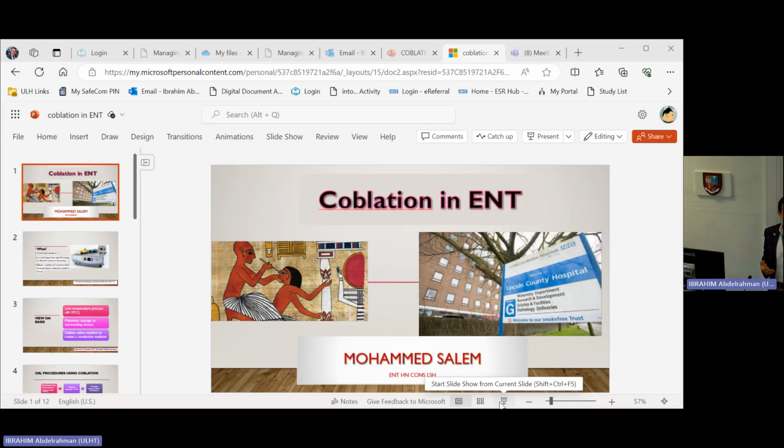But if you do the extracapsular, and Mr. Simon will show you some videos, you do it the other way, going between the tonsils, and because it will vaporize the tissue anyway, you vaporize the capsule more and separate the tonsils, like you're taking the tonsils from the back and pushing the muscles away. It depends on how much you've done. Yeah, I agree. And by the way, the chance of bleeding is there.